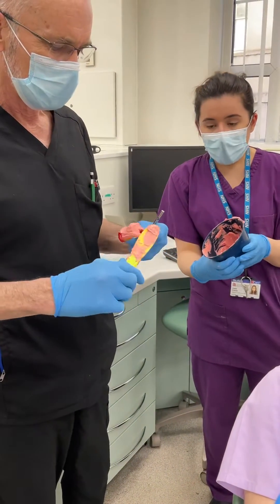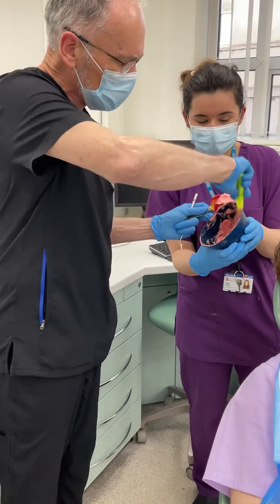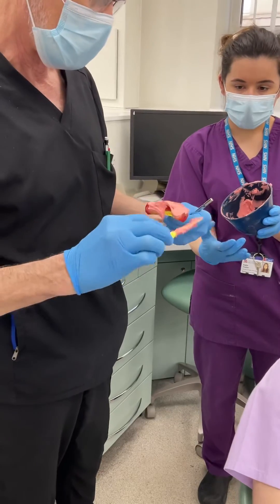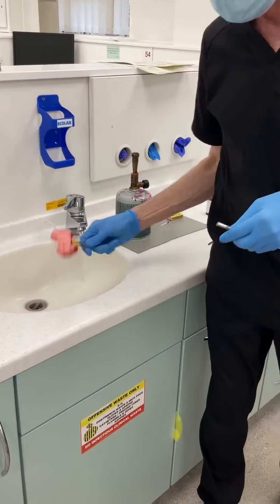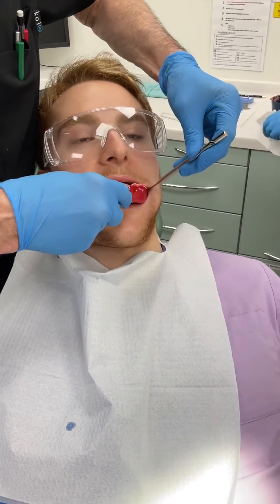Load the tray, come on the other side, load the tray on this side. All we're trying to take in our impression here is the palate and the molars — we don't want anything to do with the anterior part of the impression. So the tray is loaded, under the tap, seat the tray in the mouth.